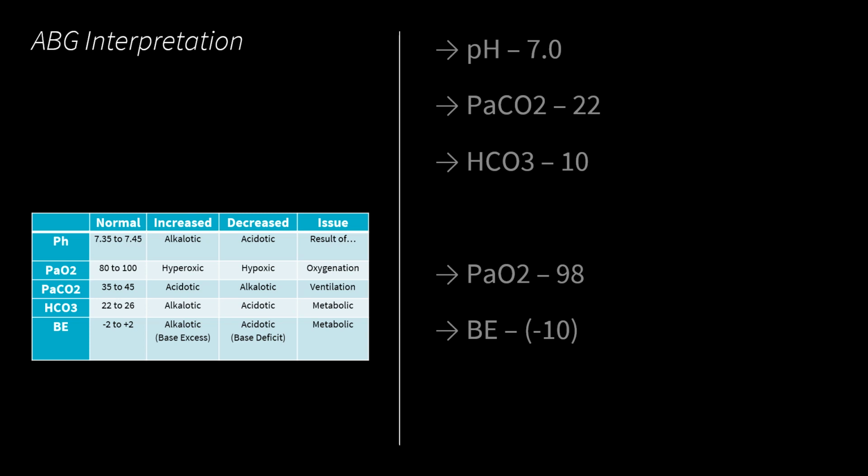So when I look at the CO2, I go back to that one. That's the only other mechanism left, and I ask myself, is it contributing to the acid in the system? Is it doing nothing, or is it trying to help? And since it's a base and our pH disturbance is an acid, I know that the respiratory system is trying to help. This is respiratory compensation.